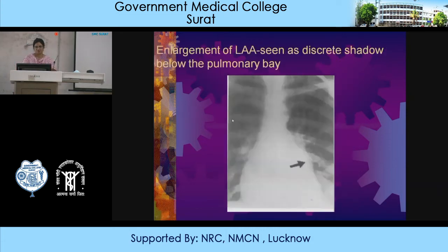This image shows uplifting of the left main bronchus leading to an increase in the angle of tracheal bifurcation. You can see there is a discrete shadow — ideally it should be flattened, however there is a convexity because of enlargement of the left atrial appendage.